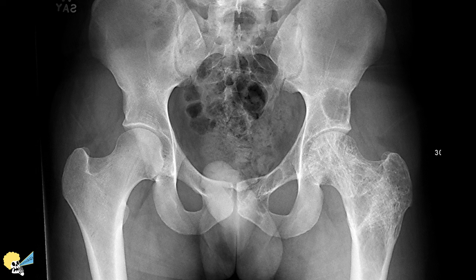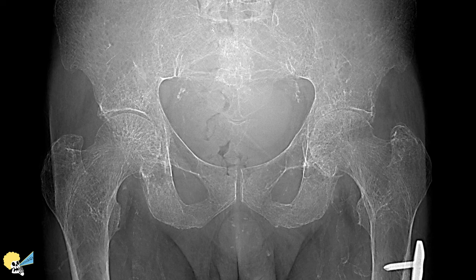On the other end of the spectrum, we have a case of thalassemia, where we can see diffuse osteopenia and apparent prominent trabeculae, especially at the right proximal femur. But as you can imagine, this is sort of an optical illusion, and the trabeculae are in reality thinner even though they look more prominent.